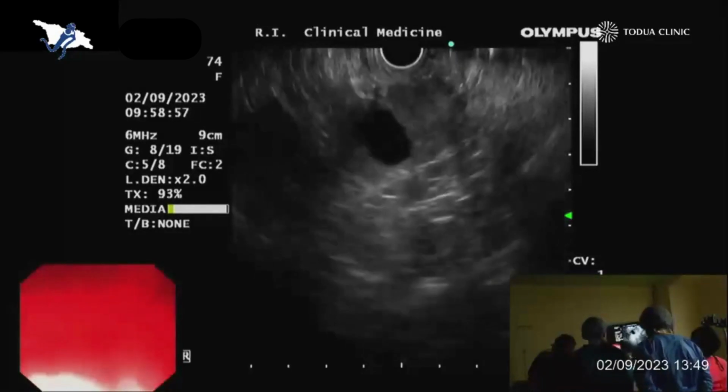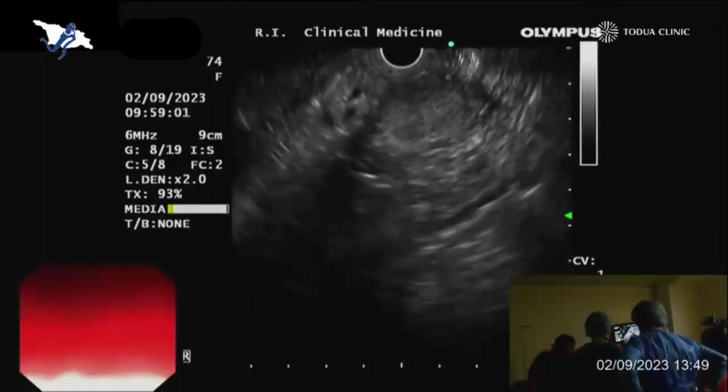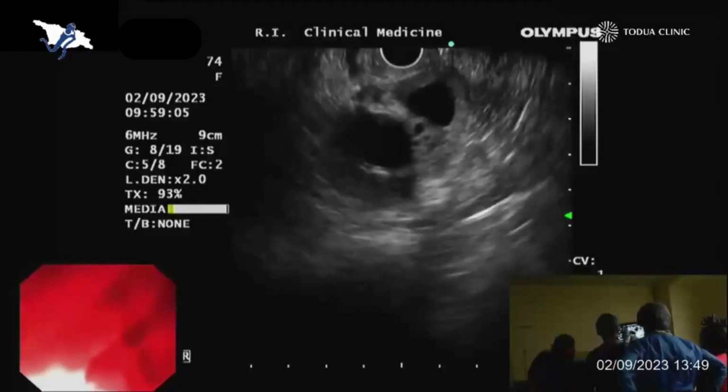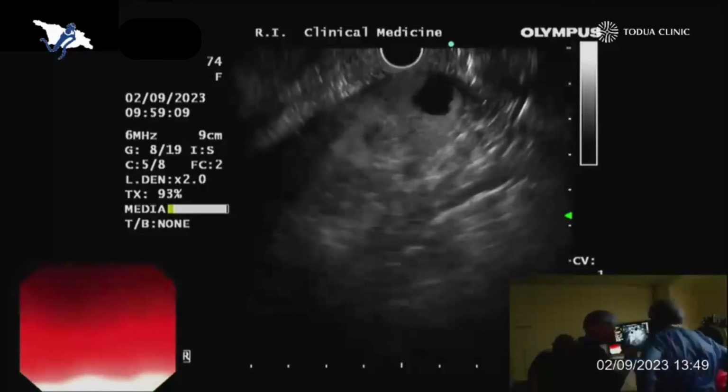Pancreas can be said, right? Is that tumor outward or? No, I will try to get the outward here. Outward. Yes. Okay, so this is the 20.